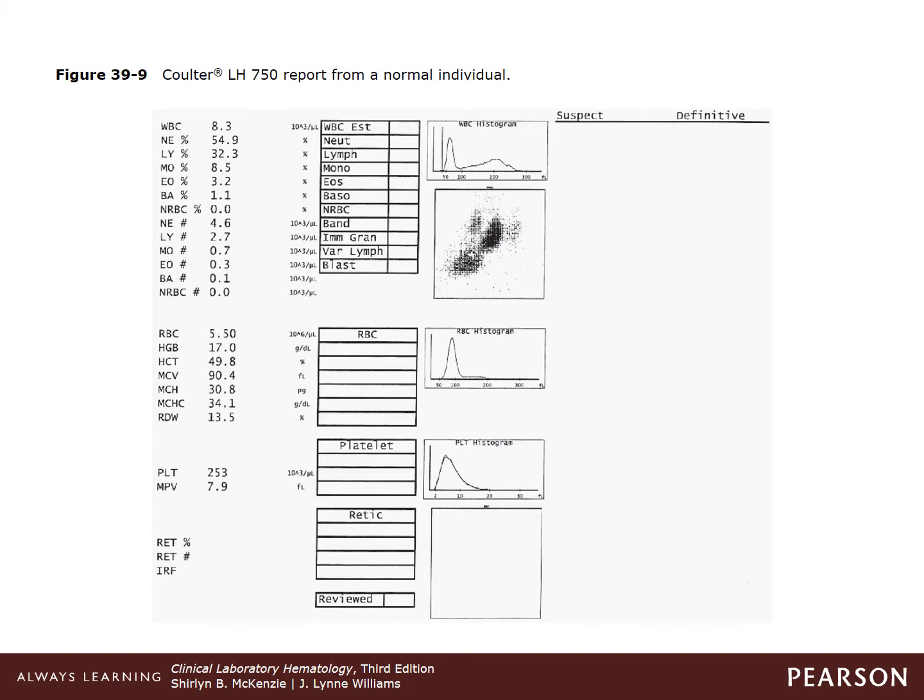Okay, a second aliquot is taken and delivered to the white blood cell hemoglobin chamber, where the leukocyte count and hemoglobin determinations are made. Here the white cell count is directly measured by impedance from the dilution after lysing all of the red cells. As the red cells lyse, they release hemoglobin from the cells.